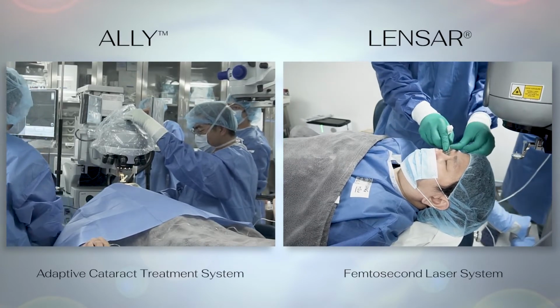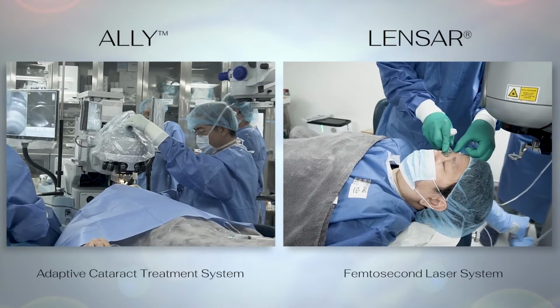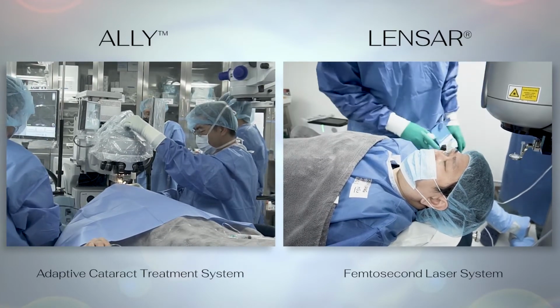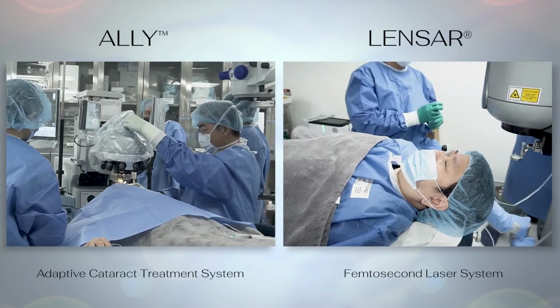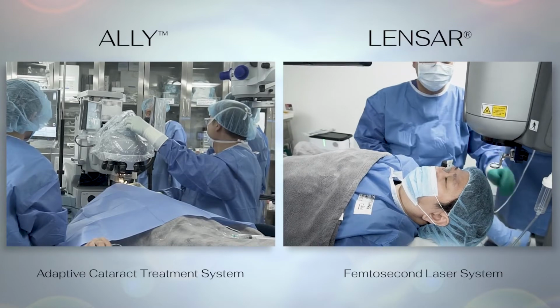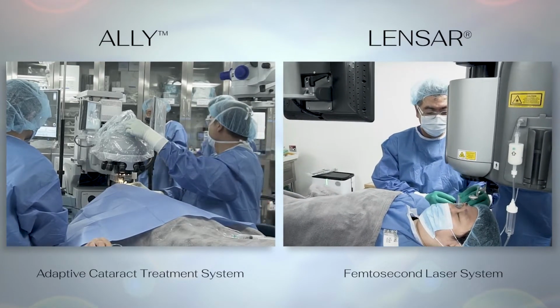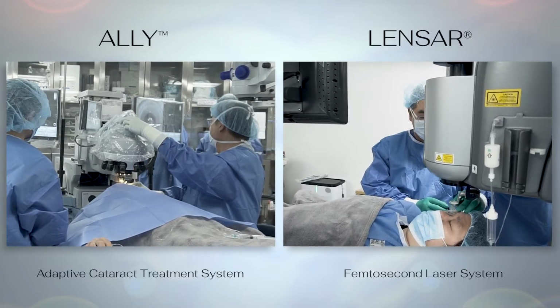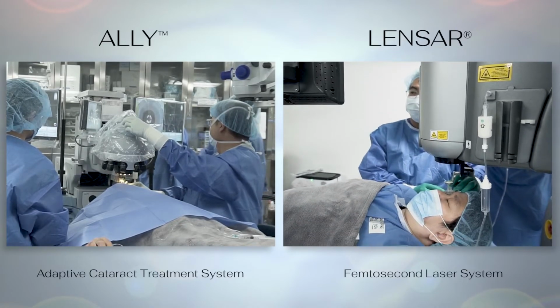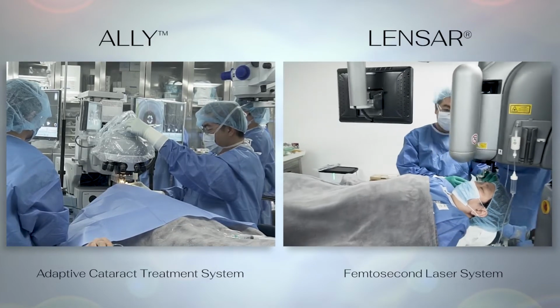But you can see that this small lead is basically obliterated, and using the Ally system quickly allows you to overtake the LENSAR system. We found that the suctioning using the Ally system is a lot more robust. You're able to latch onto that eye much more firmly and quickly. And with the small Asian eyes that we deal with, we're able to do the Femto system even with the original large round PID. The suction enables us to do even difficult eyes.